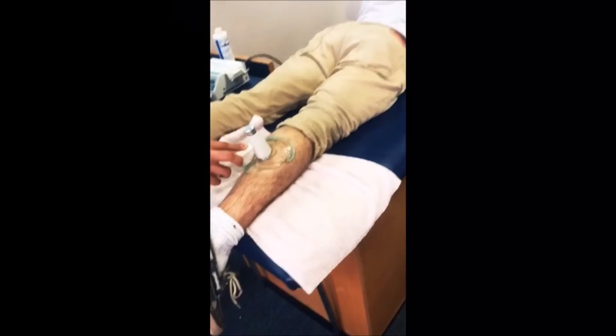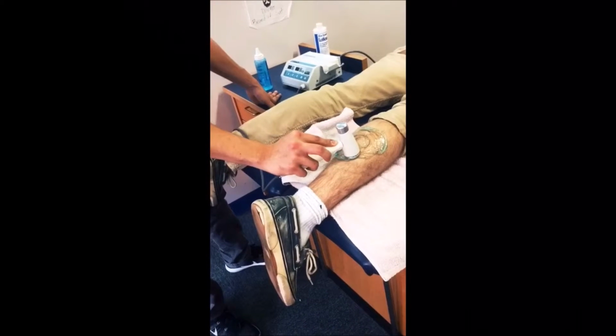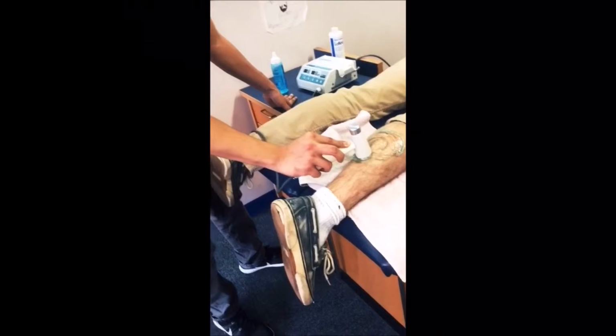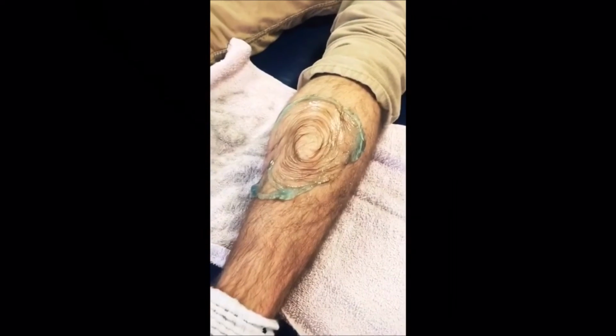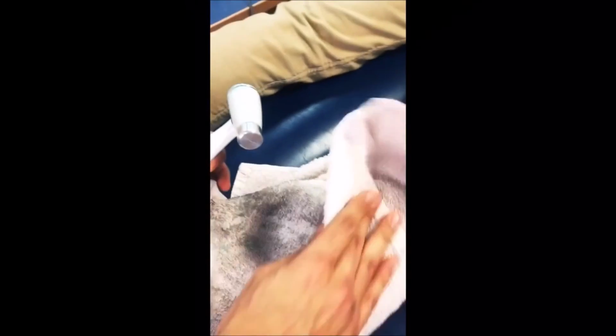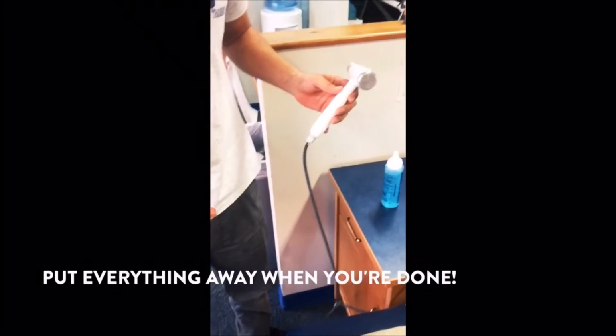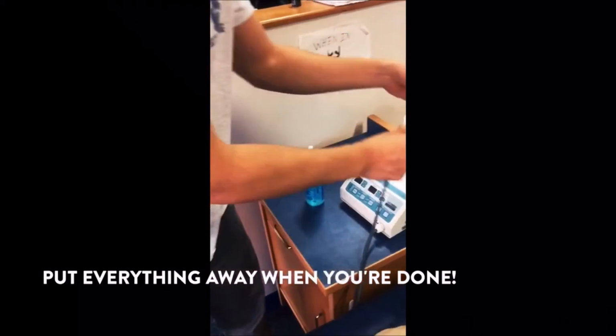Turn the intensity back down and then stop the treatment. When the treatment's done, be sure to wipe the athlete off. Then you can take time to check the skin. Make sure the transducer head is clean. Do any therapeutic exercises you might need to do, and ask the athlete how they feel.